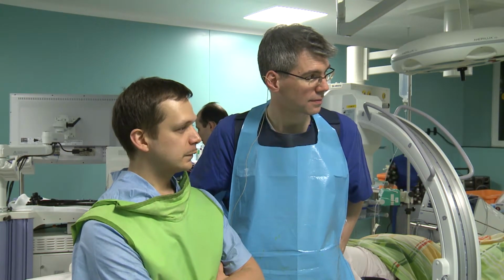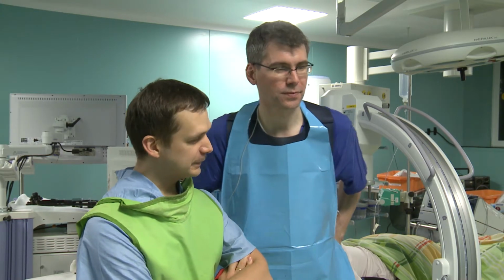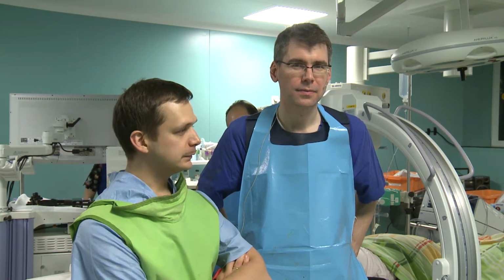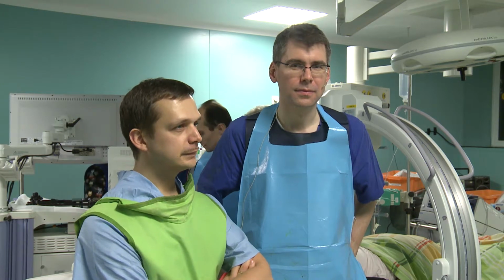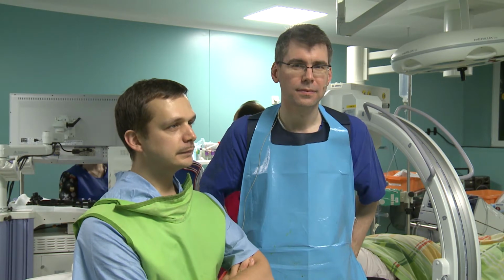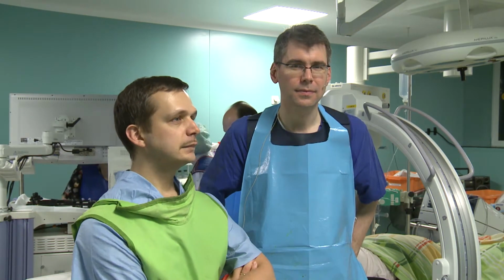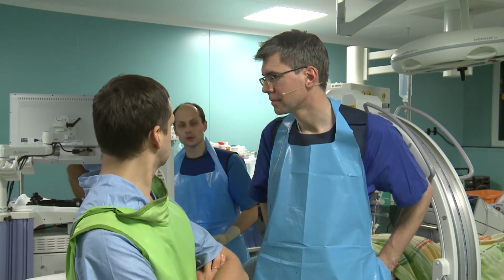So, in any case, when we talk about targeted biopsy, taking the material directly from the intraductal neoplasia, it might be sufficient for differential diagnosis. Well, the question which is still unresolved is when we see the intraductal neoplasia with the epithelium positioned within the duct, and if we don't see it in case of carcinoma, whether it's invasive or non-invasive. It is either hard to resolve this task, or even if it's possible.